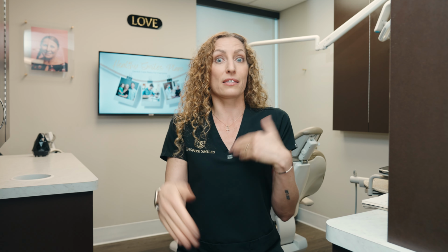Then we actually digitally design where the crown of the tooth, the part that you see in your mouth, goes. So we know exactly where this actual tooth is going, because the last thing you want is to place an implant in the bone and we can't actually build the appropriate crown. That would be just a complete disaster, right, as you can imagine. And that actually does happen quite often.